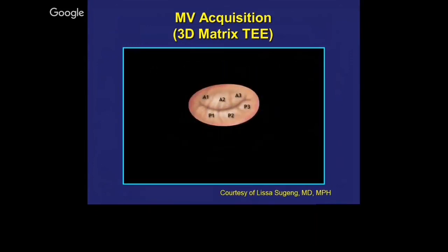But secretly, for an experienced cardiologist, do you really get more information from your 3D, or is it just pretty views? No, I think there are a couple of things. In terms of better estimation of the LV function, the 3D has definitely been proven to be superior. And especially in terms of mitral valve disease, mitral valve repair prior to surgery, it's not just pretty views. It's something that you might not see on your 2D. Sometimes you might just think it's prolapse. You don't see a flail chordae, ruptured chordae sometimes, and then you see that on 3D. So yeah, there's incremental information from it.